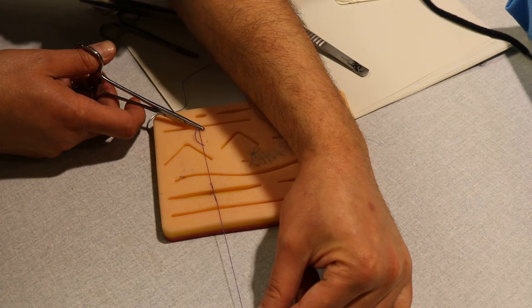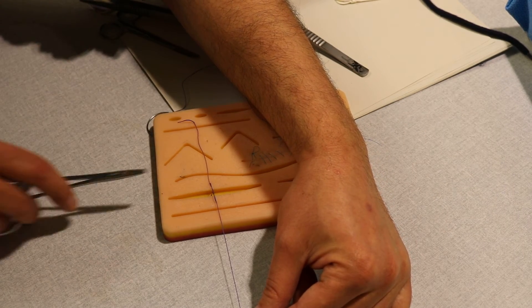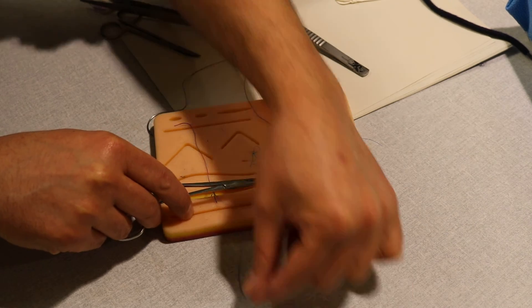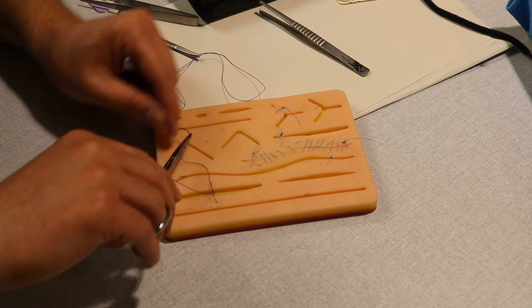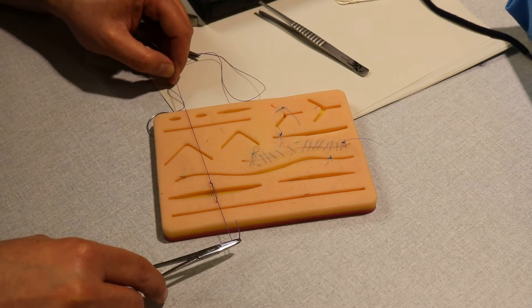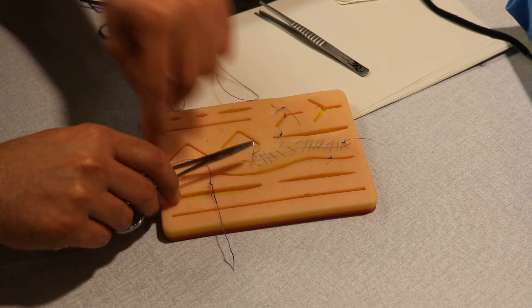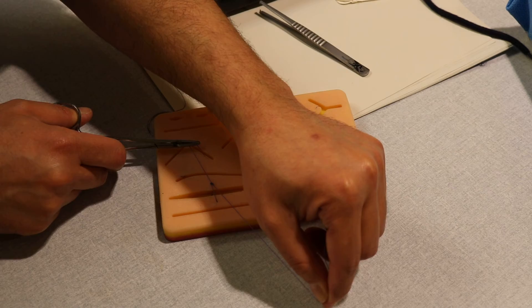The next one, you can guess. You can go again: rotate that, a loop, bring that here and go here. Again, rotate, go that, go that.